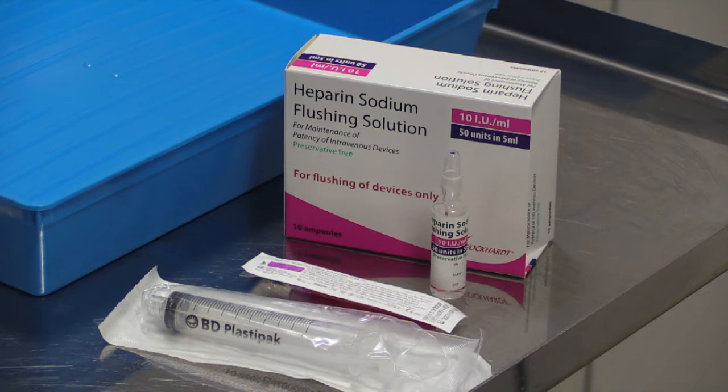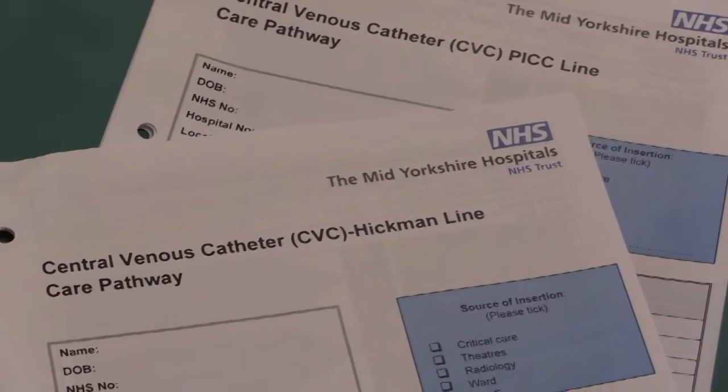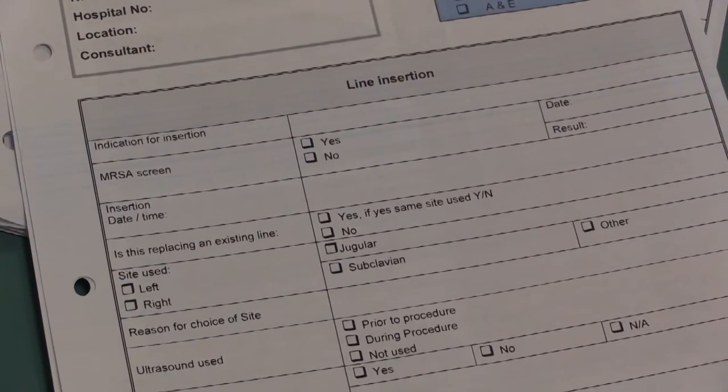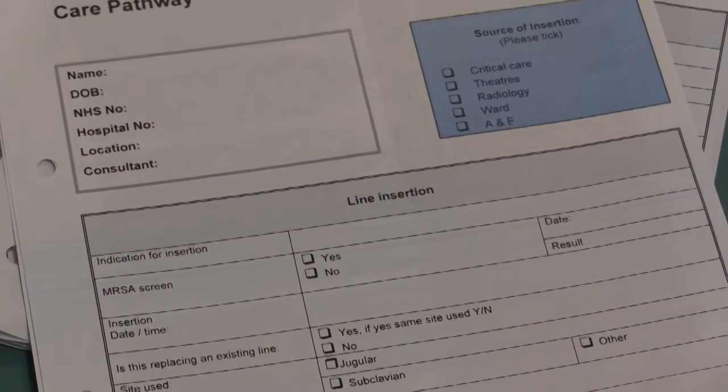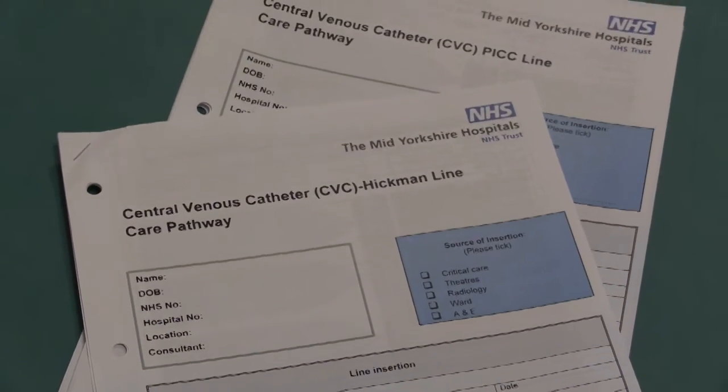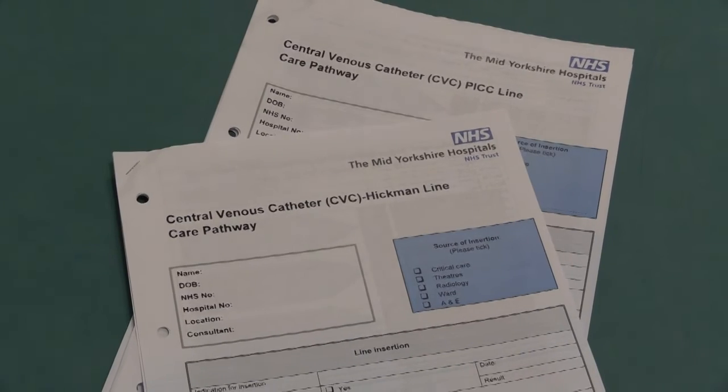If the line is not going to be used in the next 24 hours, then 10ml of heparin sodium flushing solution should be injected in a steady slow motion into the line. Re-check the clamp is securely closed and show the patient. Dispose of all waste, remove gloves and apron, wash hands, and then complete any paperwork necessary, including the trust line care pathway.